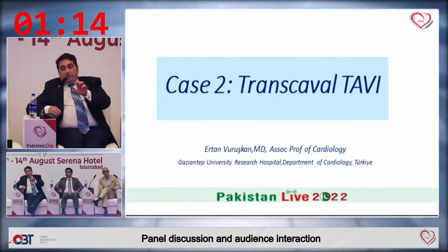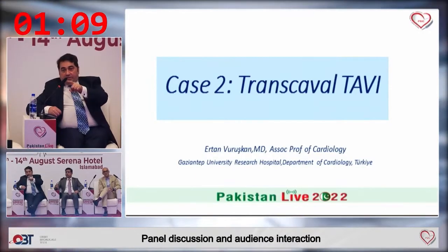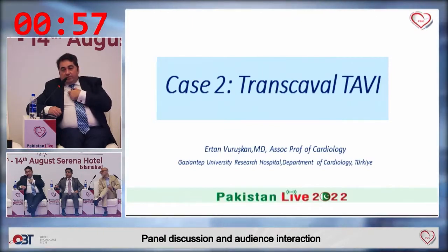Commissural alignment is very important. Bear in mind that we are getting younger and younger patients now. So there's a technique where your port should be at the three o'clock position. You're going up, your top hat is towards the outer side of the angle, and when you're deploying it, the C-arm is towards either side, because these posts come in front of it. So that's for the commissural alignment. Cusp overlap technique is mainly for the depth, as Dr. Thaisagar mentioned as well. You will see our TAVI Assist device. We have made, first time ever in the world, a system, an app, where it can tell you how the S-curves work. We are presenting it in a bit, so probably we'll go into that detail then.